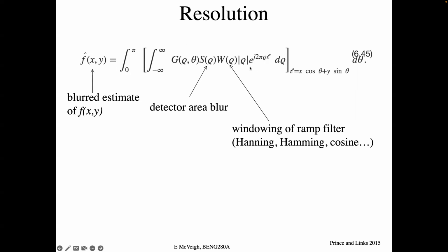And we have the K term here, I don't know why he uses these letters, which is the ramp component. We also have that windowing function, and that's where you cut that ramp off. So we saw the ramp go up and then it went down to 0 like that. So the width of that window is also something that's affecting what your resolution is going to be.